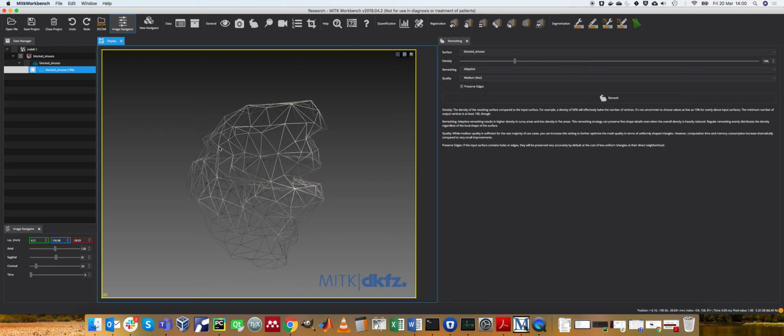This would give you a surface which you then give to your program, and the graphics system will just happily render these as a bunch of triangles in a certain color, and it will do it very quickly. And that's, in a nutshell, the overall process of doing a segmentation, converting it to a surface so that we can do surface-based visualization.